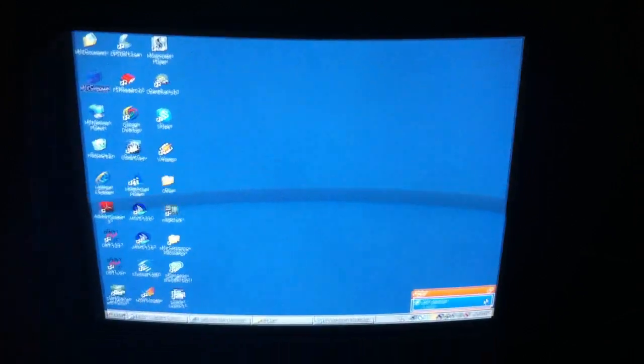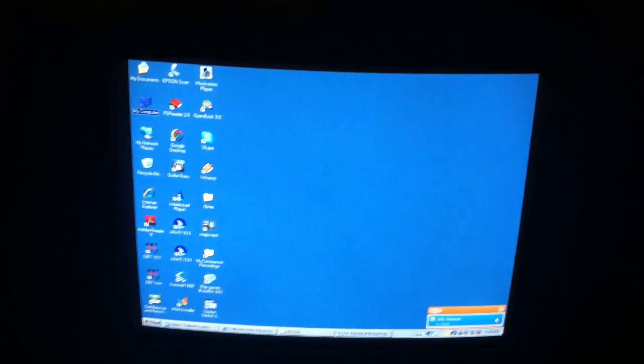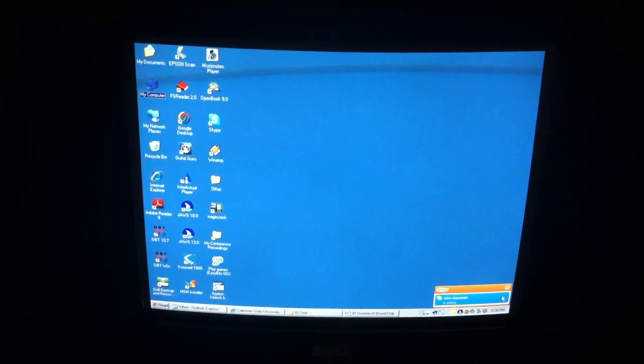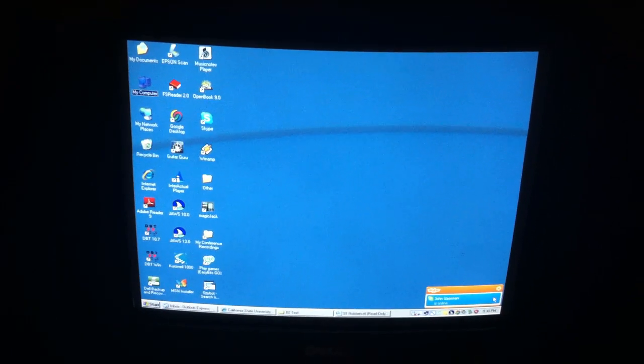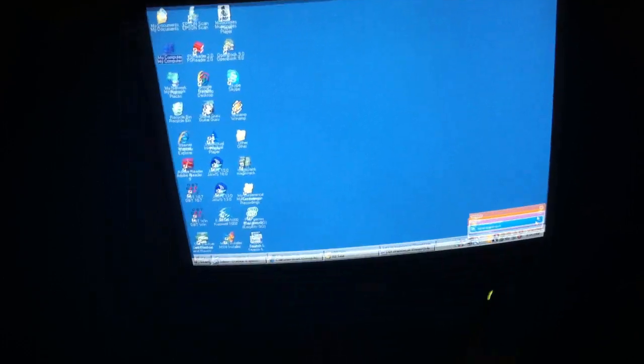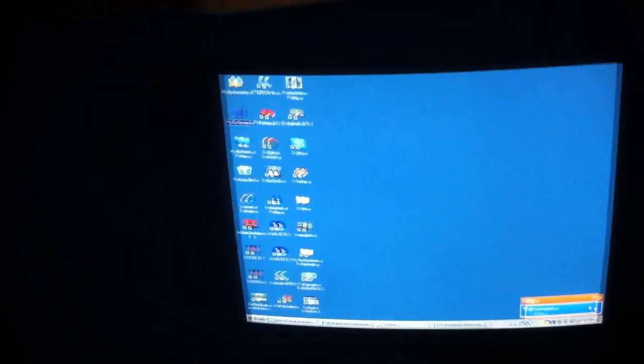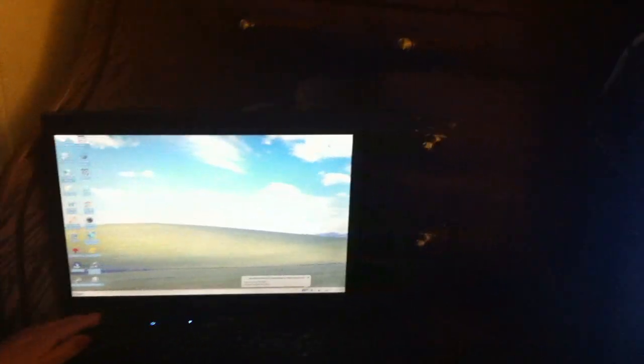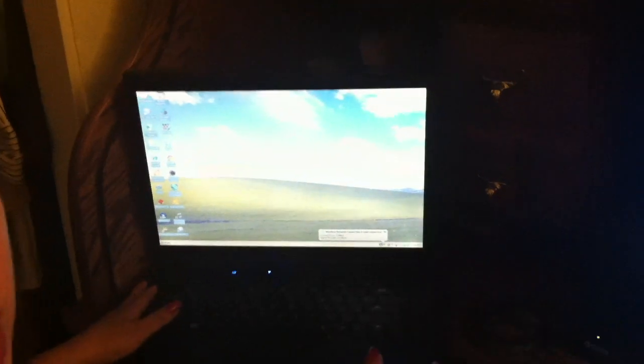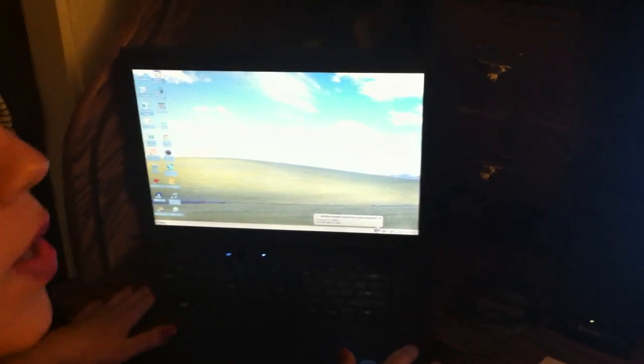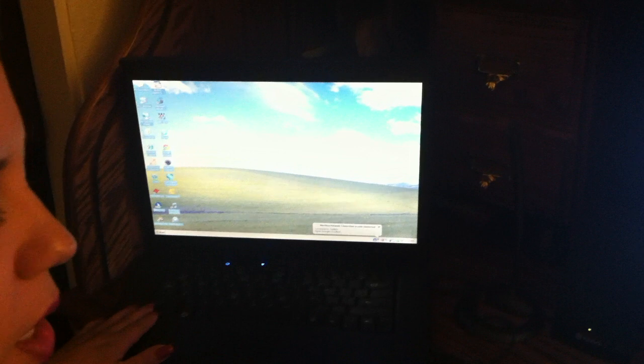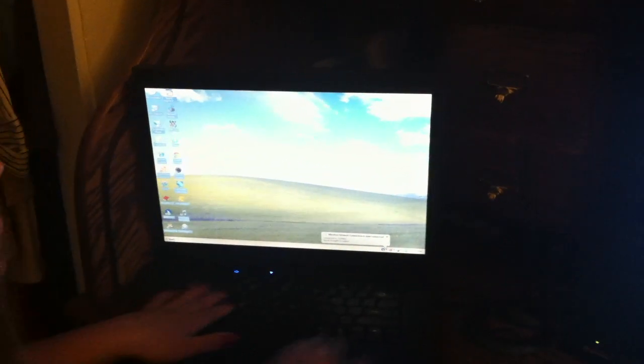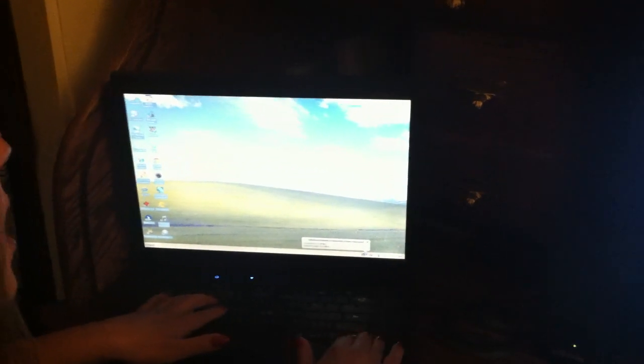And then if I want to open a Microsoft document, I'll do Control-Alt-W. So it'll open up a document if I want to type whatever document I want to type. I also have a laptop, which I also have the JAWS program.